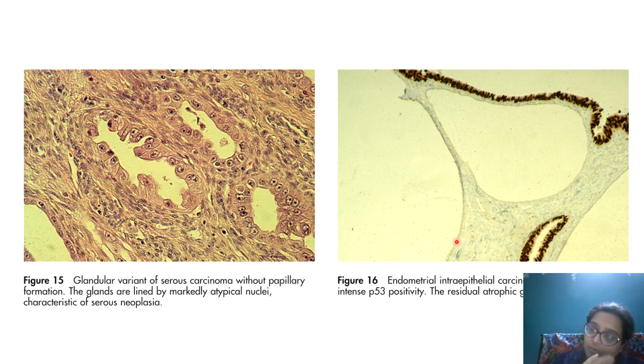Smooth muscle actin is normally present, but leiomyosarcoma is a tumor originating from the smooth muscle. So उसमें उसका expression बढ़ जाएगा.